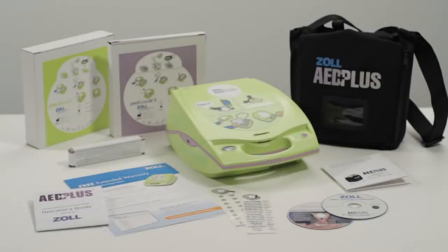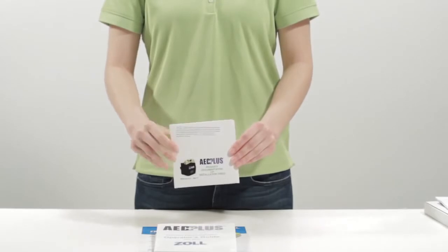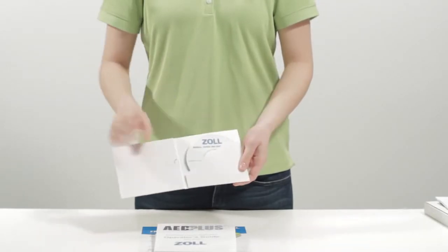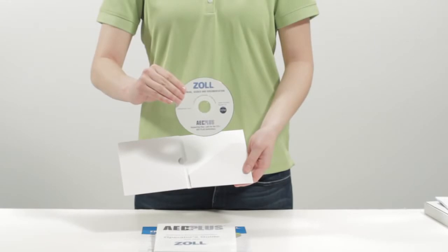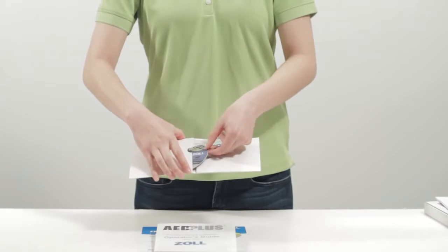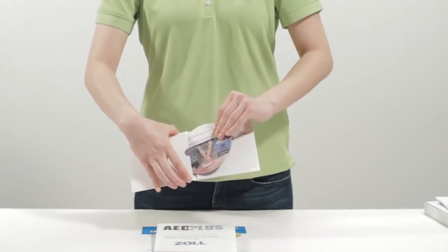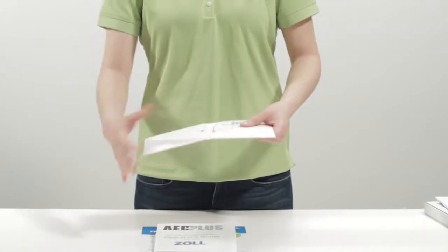Now that we've installed the pads and batteries, we'll review the documents, labels, and CDs that came with your AED Plus. This envelope contains 2 discs. One is your AED Plus documentation CD. It contains PDFs of all your AED Plus documentation, including the Administrator's Guide, which provides detailed information about your AED Plus. The other is the DVD that contains the video you are now watching and another video showing how to use the AED Plus in a rescue.